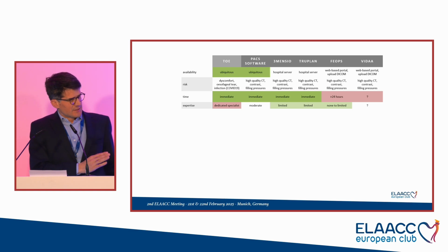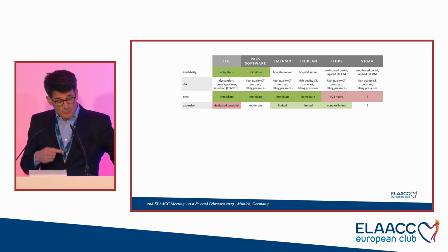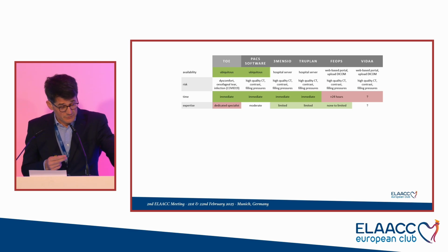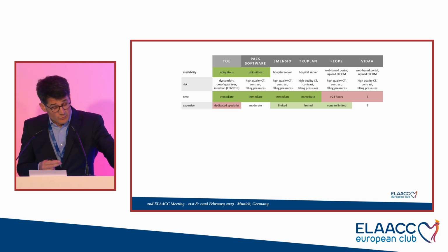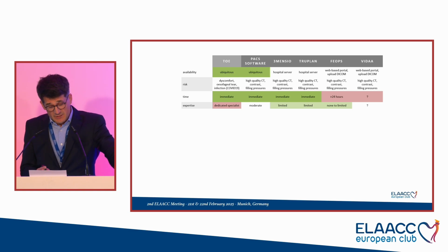There are some risks that we've discussed, and absolutely, I can't agree more. I've lost a patient in the early days where we wanted to exclude the thrombus before, and the patient died because of an esophageal tear. We had some problems of infections during the COVID. Since COVID, I've stopped doing TOE, and I've completely switched to CT. CT is using radiation, it's using contrast, but I think it's acceptable for the elderly.